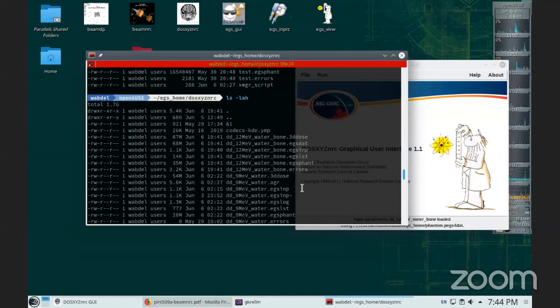Why is it double? Because we have values of the doses, but also values of the standard deviation. So for each voxel, we need to record probably 2 things, dose and standard deviation. It actually records something else, but just so that you understand, the data stored is more than just the dose.